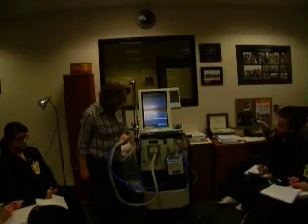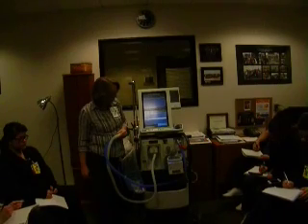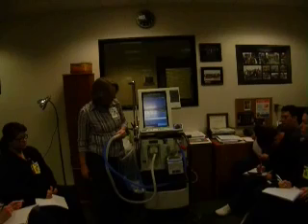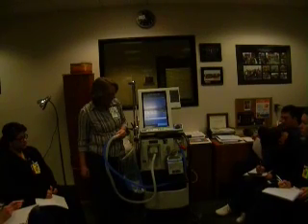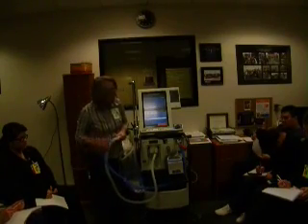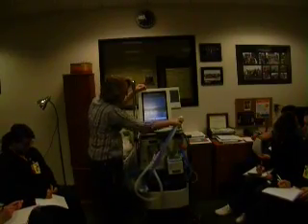And now it's doing circuit resistance. We did our leak, our expiratory filter. Now it's doing its resistance. It's just testing the resistance of the circuit here. Unblock Y. That's when you go, thank goodness. Press accept.